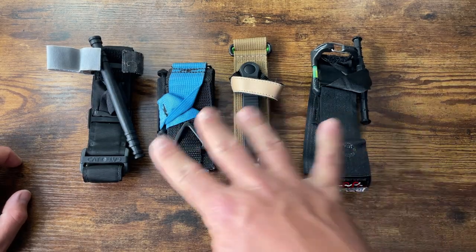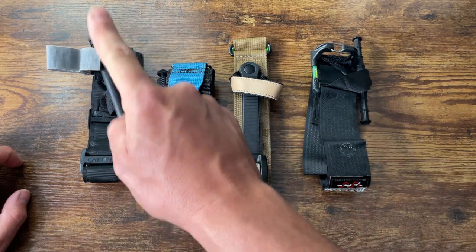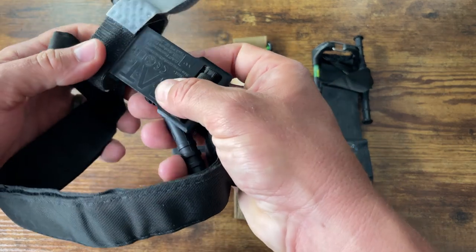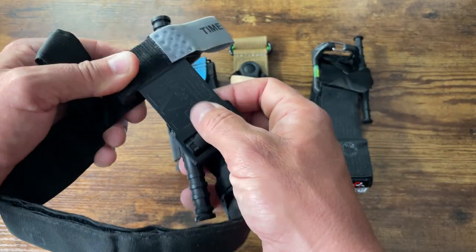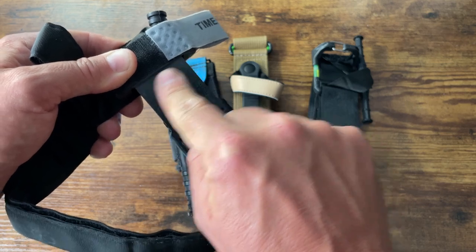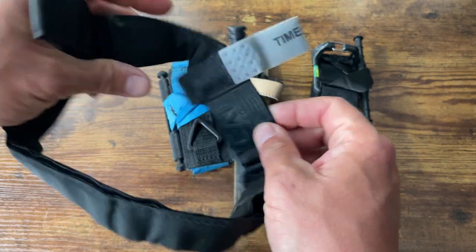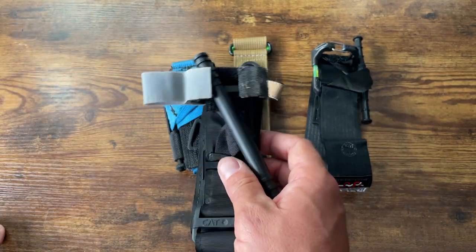Those are some tourniquet options - these are the ones I like right now. Can't go wrong with a good old CAT, but make sure you're not getting fake ones - there are fakes out there. A quick way to tell: on the back of the tourniquet, the lettering is raised above the panel, you can feel it - it's not flat. You can feel the C, the A, the T. The fake ones have no raised lettering - it's all flat. That said, there are a lot of good fakes out there and you don't want to be using a Chinese knockoff tourniquet in an emergency.